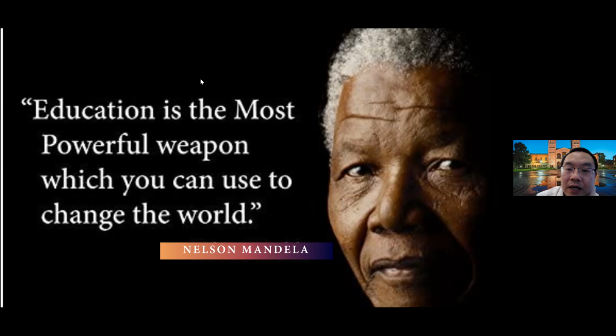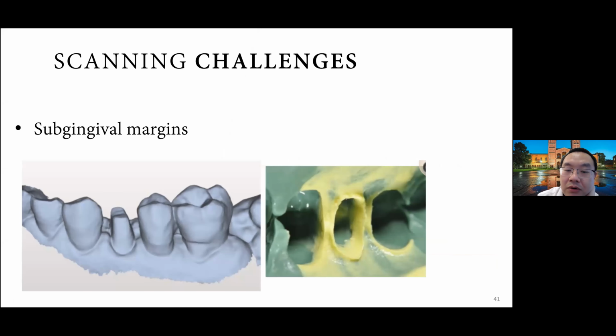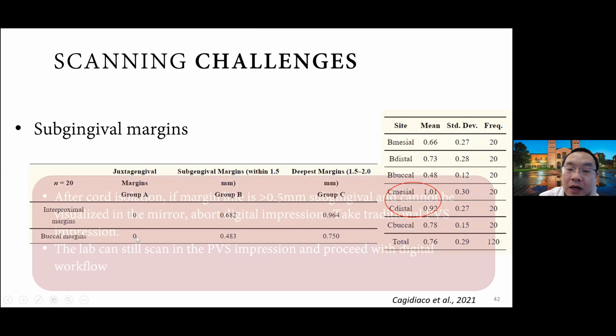And another thing right here is that on the crown margins, you can actually mark your margins on the impression, and that information gets transmitted to the lab. So the lab knows exactly where you want the margins to be. If you have an ambiguous part of the margin, you can mark it and send it to the lab and make an annotation, make a comment, so they know to look for that margin exactly where you want it to be. So it takes the guesswork out of it.